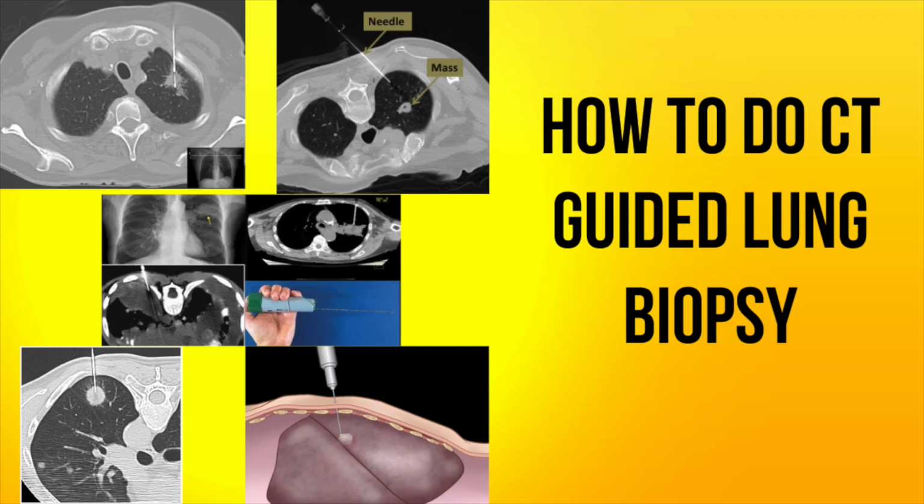Hi everyone, I'm Dr. Eben Jules, an interventional radiology resident, and in this video, I'll walk you through the overall workflow of a CT guided lung biopsy using real case images from my institute.